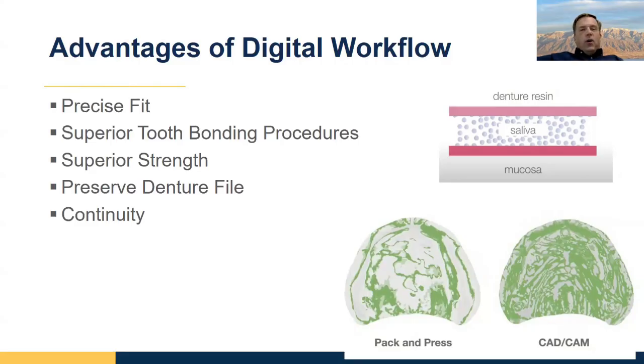The last thing I want to talk about is continuity, because when I've talked with dentists who have done a lot of digital dentures or who have switched from a pretty heavy analog denture process to a heavy digital denture process, what they found is that they've gotten away from that feeling of, okay, I'm opening the box, I wonder what I'm going to get. There's a lot of pressure and braking and different things like that that you have to do, as we saw last time with the analog process, that can lead to, I guess you might say, distortion, damage to the denture during the fabrication process.